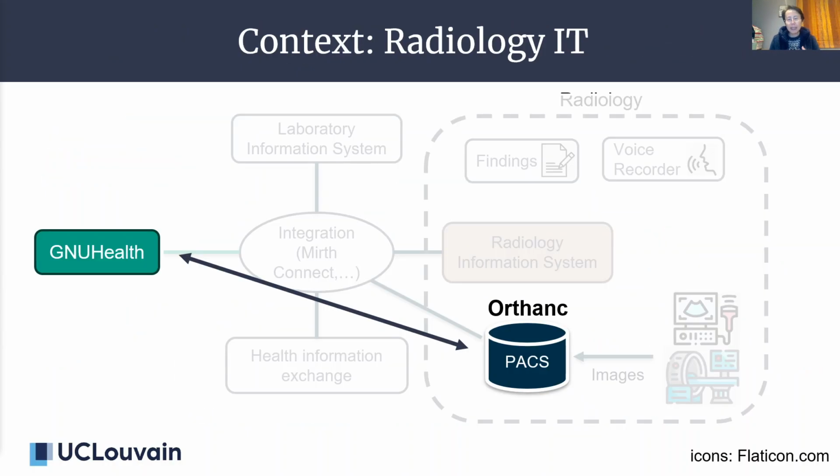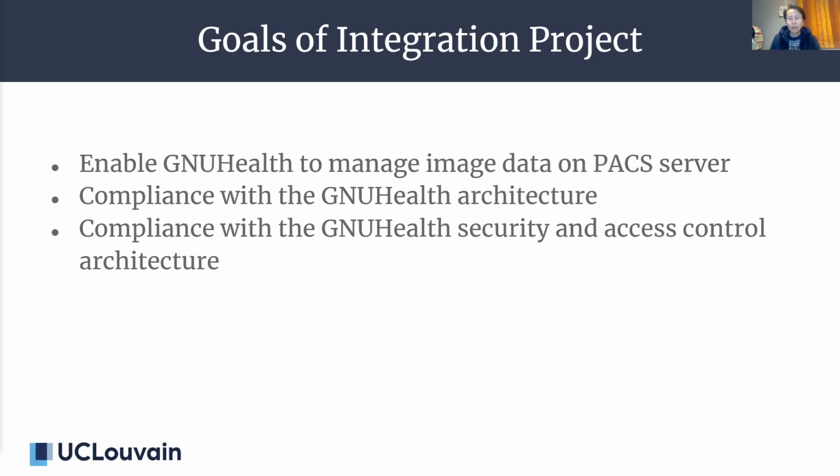This slide explains the goal of integrating GNUHealth with the Orthanc PACS server to create a connection. The Orthanc server can be either local or remote. The goal of the integration project is to enable GNUHealth users to browse, view, and manage the image studies stored in the Orthanc PACS server.